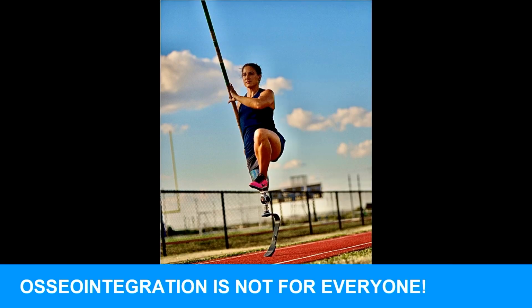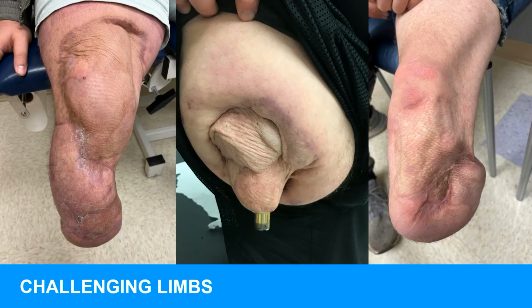So, as everyone said here in the group, osseointegration is not for everyone. It was designed initially for challenging limbs, and probably, I'm going to make up a number here, but probably 33% of our patients come to our clinic with extremely challenging limbs. The other part that's difficult for me, because I love sockets, is sometimes we see a great residual limb shape, a knee disarticulation, a good, long, strong limb, and the socket design was improper, and that's why patients are coming to us for osseointegration. So you don't have to simply go from being an unhappy patient to OI.